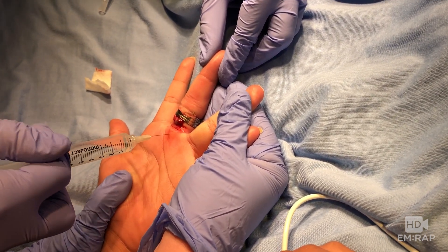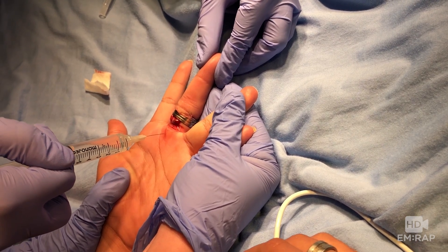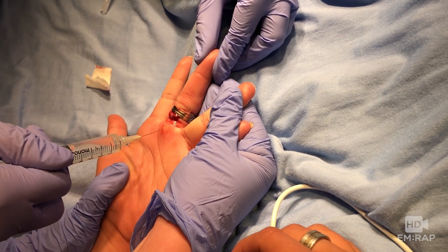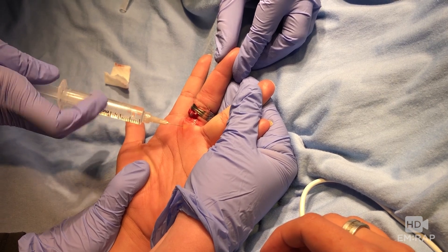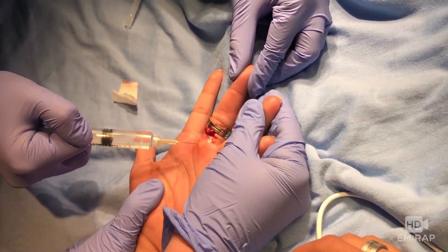The metacarpal head is palpable. Advance the needle until you touch bone, and then back it off just a little bit. Aspirate and inject three mLs of anesthetic. This should anesthetize all four digital nerves, but a nice adjunct is to slightly withdraw and re-angle the needle tip towards each web space, delivering a little more anesthetic to each side.